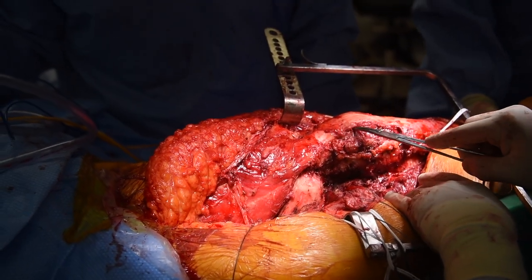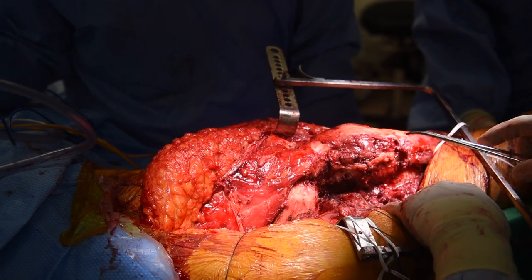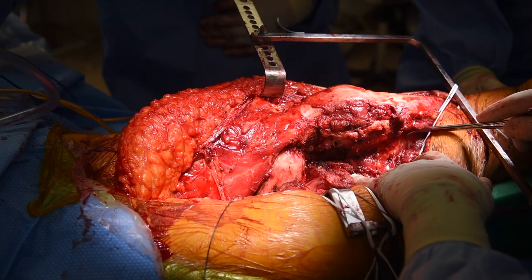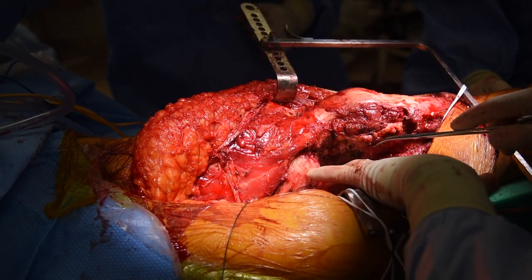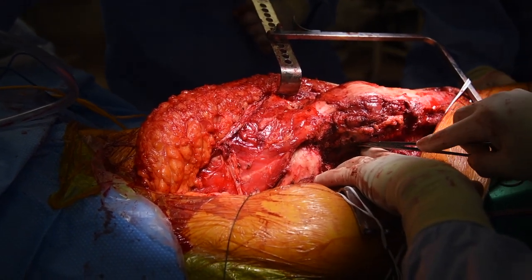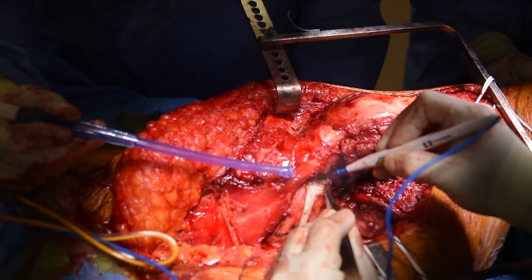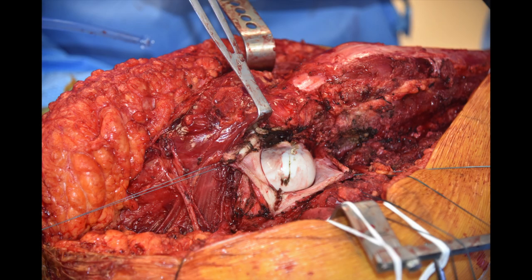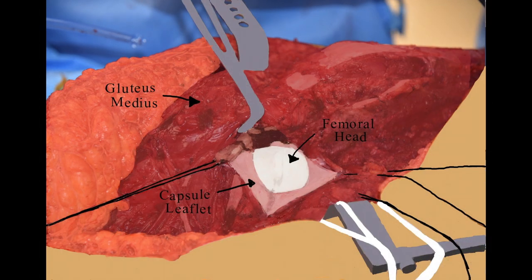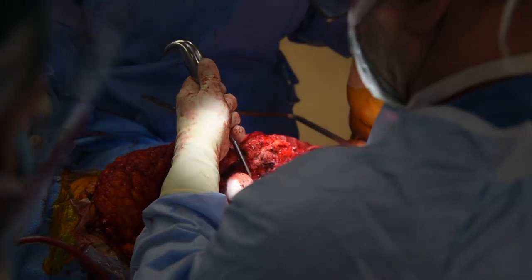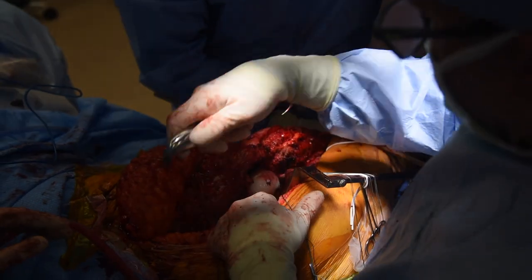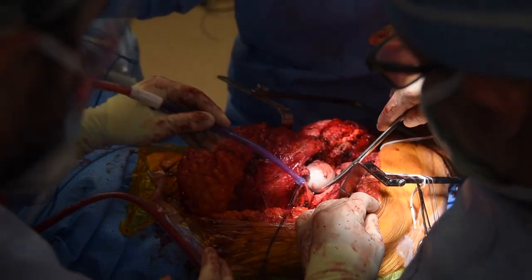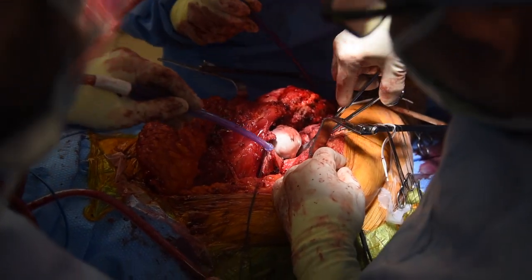This is the vastus lateralis, which we should save some of, though some may need to be removed. Here are the hip adductor muscles; deep to these we will find the profunda vessels and ligate them. Here is the lesser trochanter; we will save the iliopsoas muscle for later repair. Here we have made a T-shaped capsulotomy with the capsule leaflets tagged with suture. We then dislocated the hip and created a digastric osteotomy in the greater trochanter in order to save the insertion of the gluteus medius and minimus and the origin of the vastus lateralis for later repair onto the prosthesis.